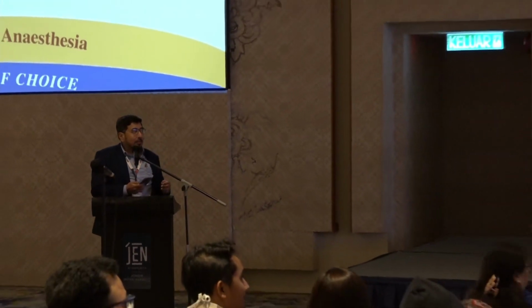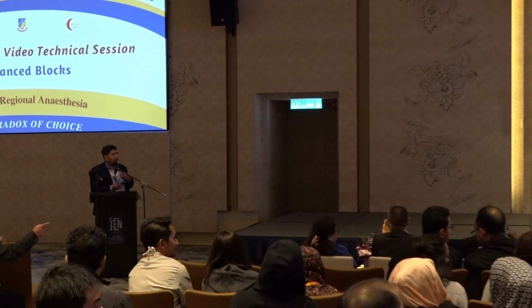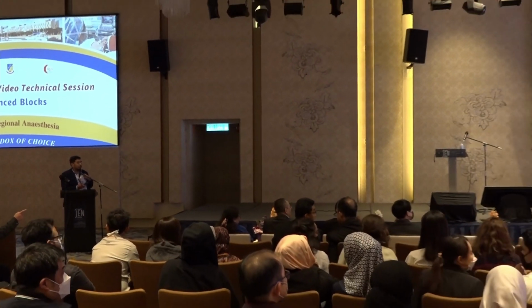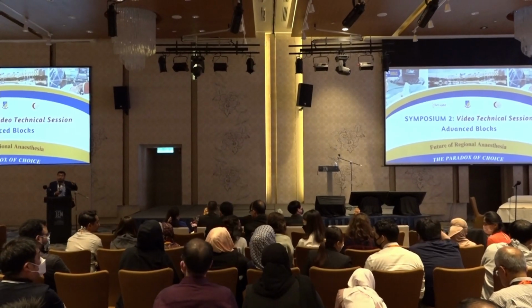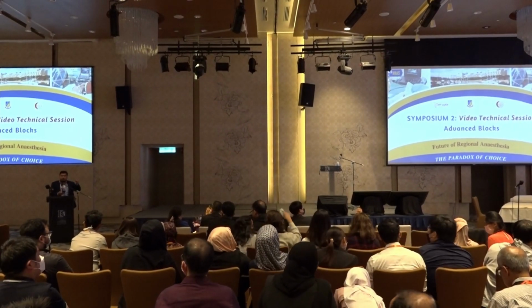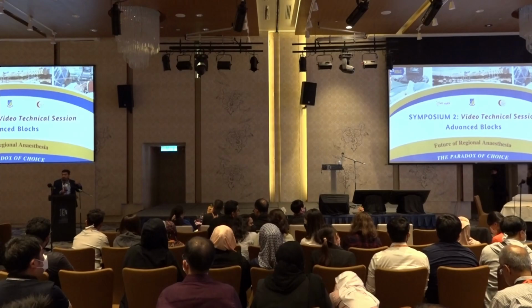Who's the model? Model is coming. So, okay, the whole idea is going to be interactive. So you guys can ask them to scan anything and ask questions. So maybe I ask Dr. Iskandar to do the first scanning. And we will also have Prof Karmakar to demonstrate to us what he talked about, probably at a later stage.